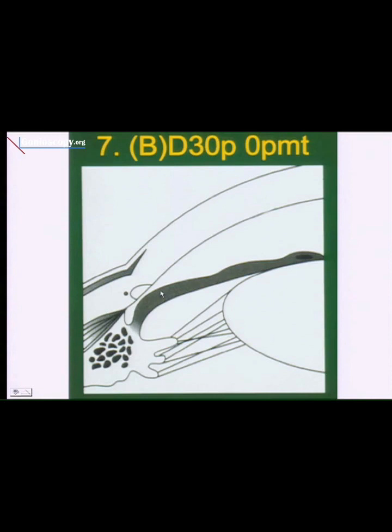So with an indentation gonioscopy, you have to be very, very gentle. Just touch that cornea. Now, the way I put on the lens in patients when I use the indentation lens, which is what I use routinely, is you're seated at the slit lamp. You don't look around the side of the patient as you do when you're putting on a Goldmann. You're seated at the slit lamp, you've got the oculars in focus, the patient's anesthetized, and you tell the patient, now just look straight ahead. You're going to feel this, but it won't hurt you. Then with them looking straight ahead, looking through the microscope, you place the mirror on the cornea.